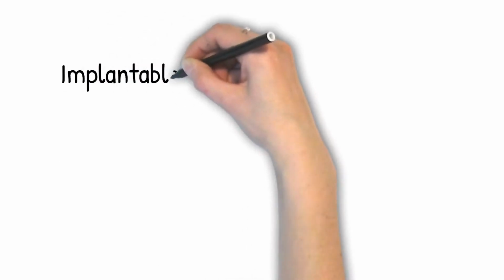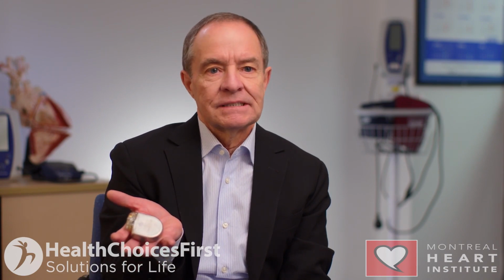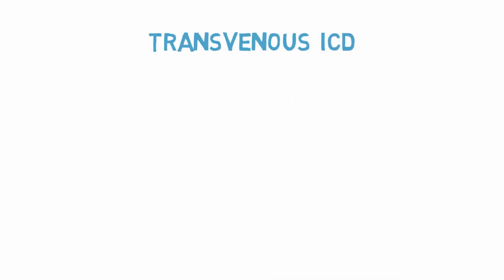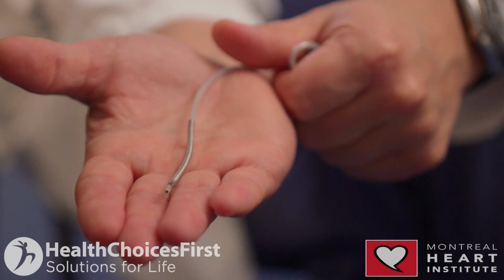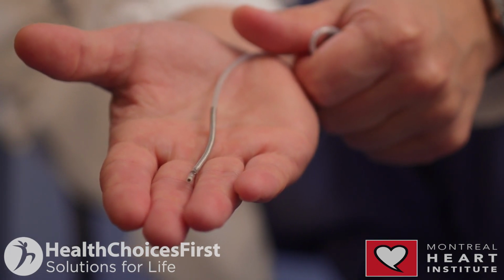A defibrillator, or the exact medical term, an implantable cardioverter defibrillator, or ICD. This is the acronym I'll be using. An ICD is a battery-powered device. Here's an example in the size of the device that is implanted under the skin, in the chest, close to the heart, and is connected to the heart with a thin wire. The technical term is a lead.